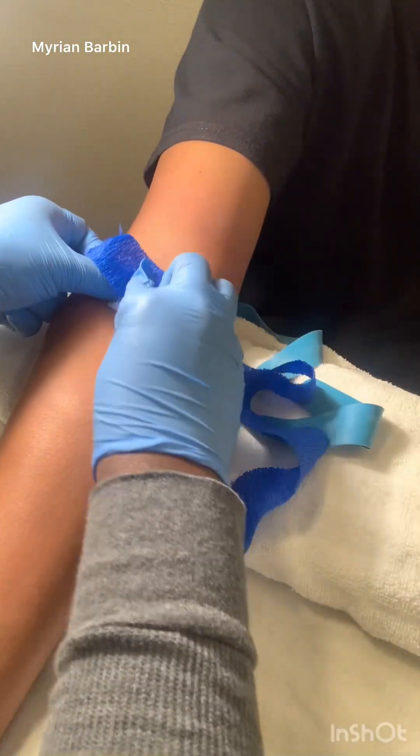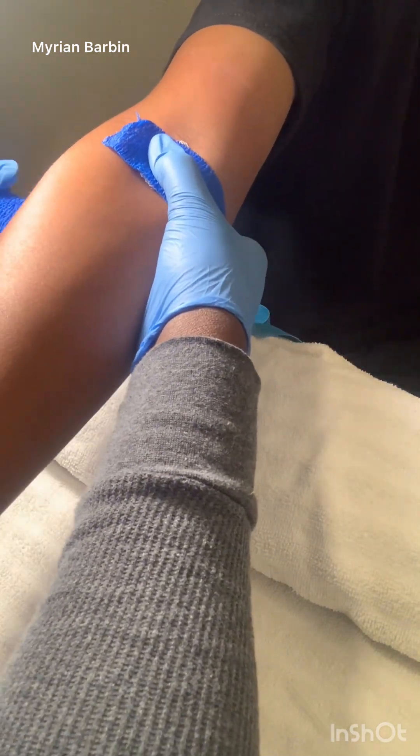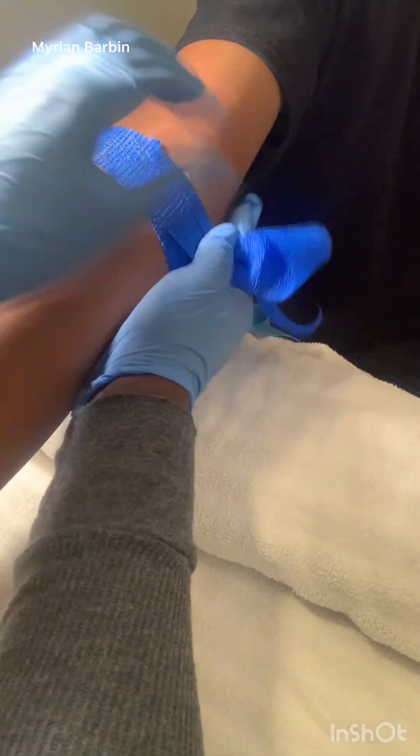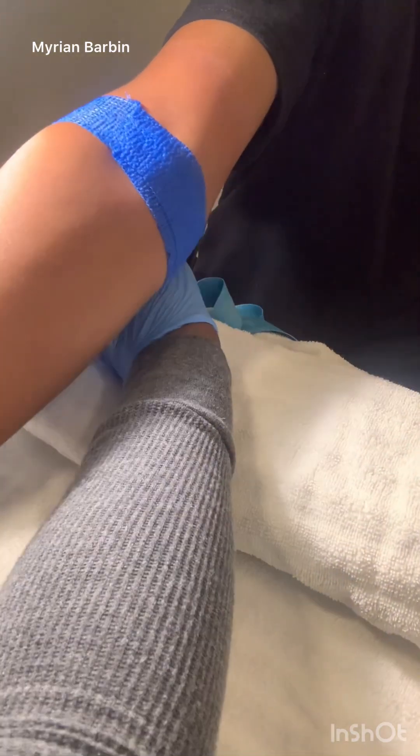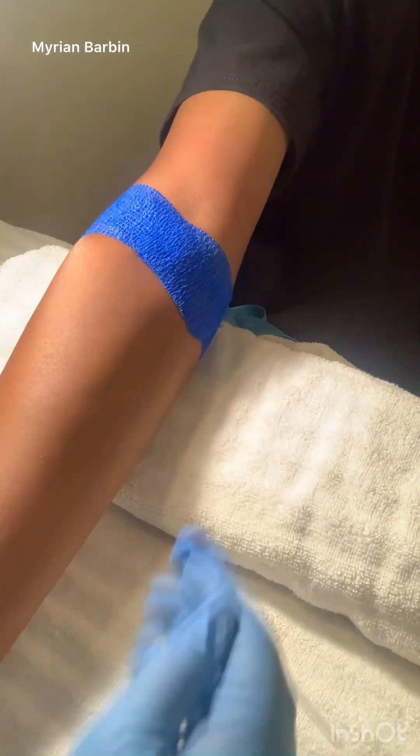Apply pressure to the site where you had the needle, and then let the patient know to leave it on for about 15 to 30 minutes.